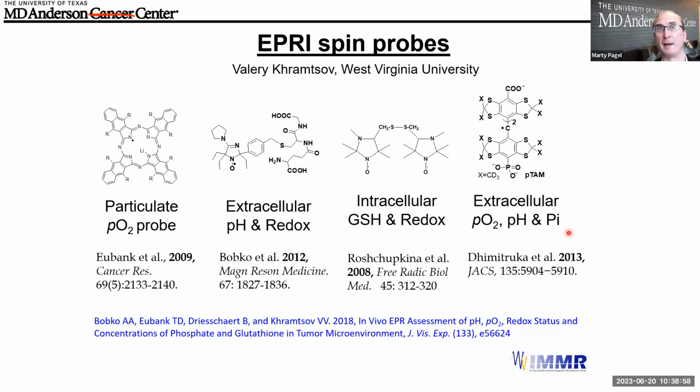And I think as time goes on, we've all seen the merits of doing multi-parametric molecular imaging. Multi-parametric MRI is now becoming a more common term, taking multiple MRI parameters together, right? Well, same here. Multi-parametric EPRI is possible, although matching the hardware with the type of agent still needs to be worked out some.